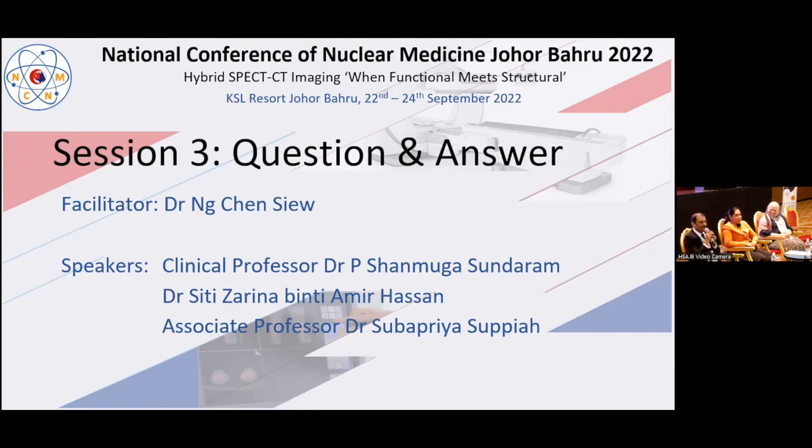It is really tough. And my personal opinion is planar is good enough. If you are unable to do a SPECT-CT, I will prefer to do only planar because it is really difficult. So having told that, your question is very pertinent, and I will not be really able to add much to your difficulty, because as I accepted already, it is definitely tough. So the only technical difference that can be done is the initial and delayed scan and initial and delayed SPECT, only that much we can do.